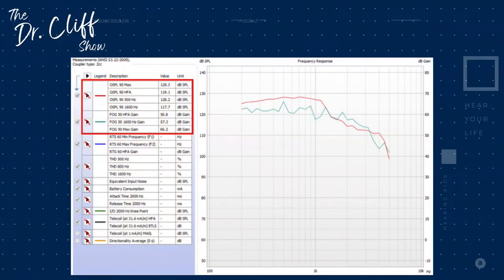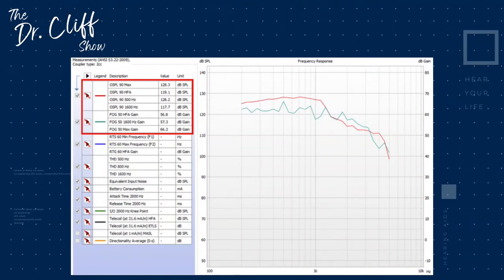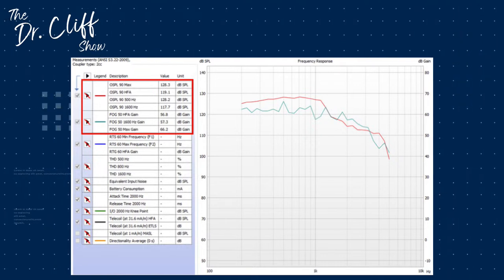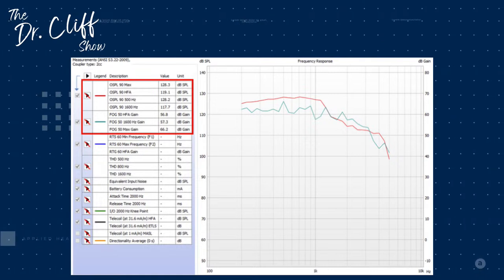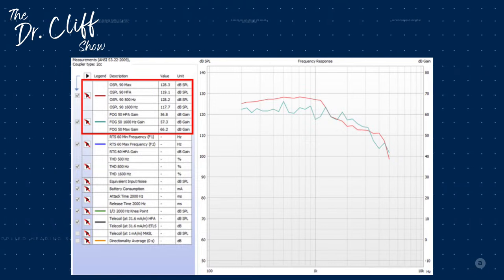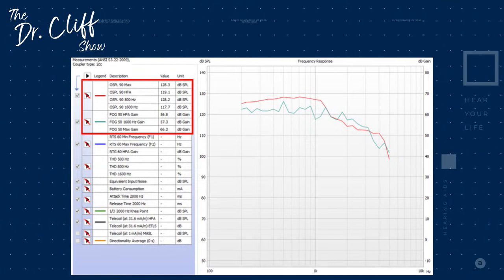Right. And if we go back to that graphic here for just a moment, we're also looking at that full-on gain. And so again, you can see those numbers off to the right. There's a couple different ones. There's a max gain reading. There's that high-frequency average gain reading. But overall, those numbers are lining up very consistently with what we're looking for out of this hearing aid. I guess I didn't pick an image that had the distortion percentages on there.